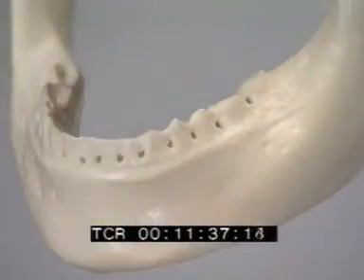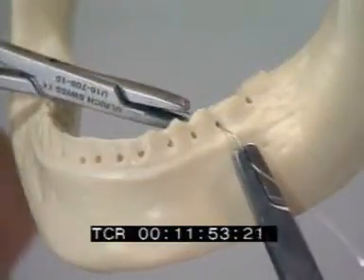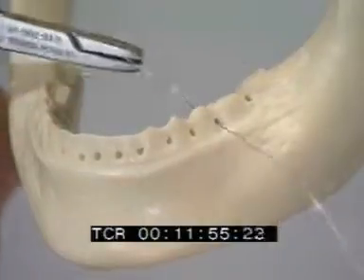An Ernst ligature is based on two neighboring teeth in the same segment of one dental arch. If possible, premolars number 4 and 5 are used in the maxilla and mandible. A 0.4 mm wire of approximately 15 centimeters length is used.